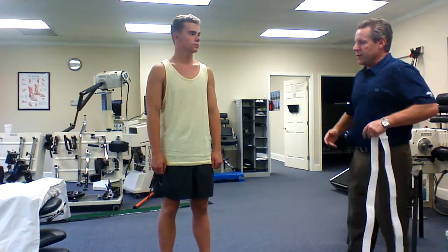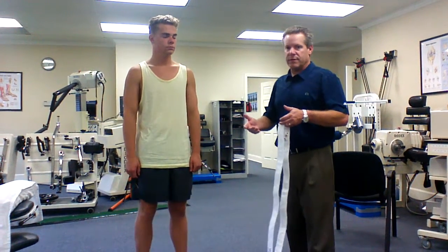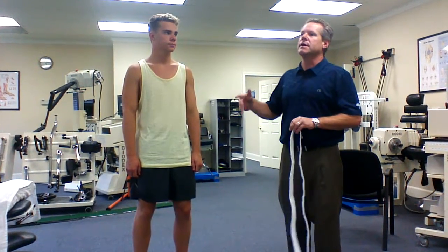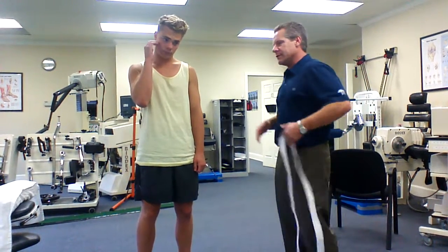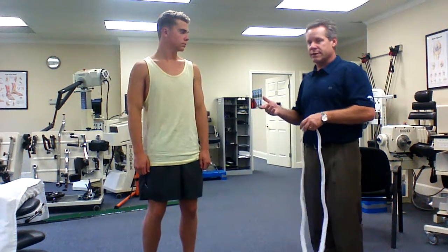They can either buy them here at the bone store or at the rehab super store. But with pelvic girdle issues, even when we correct them, sometimes there's so much laxity that every time a person comes in, they're in an awkward position. I hate to say 'out of place,' but this is the one time I would agree with chiropractors — the bones get out of place. Especially for that person who reports a lot of pain with driving, when you sit, the pelvis just kind of spreads out and puts strain on the ligaments. This is a good way to hold everything together, at least until the ligaments have shortened or we've had two or three months to strengthen the muscles.